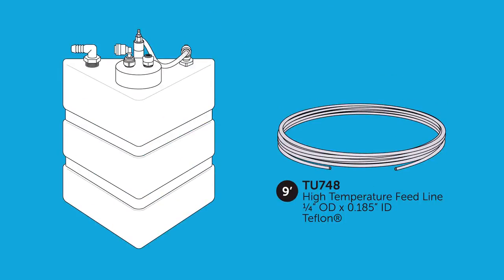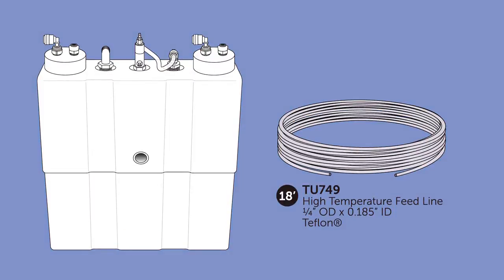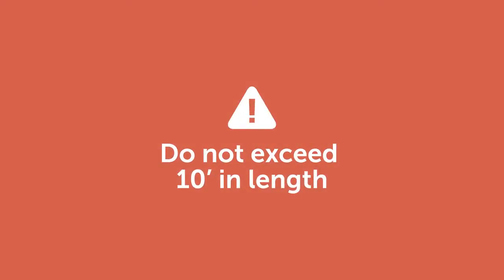A 9-foot length of the high temperature Teflon tubing is included with each model V7501 for a single autoclave, and an 18-foot length is included with each V7502 system. It's important not to exceed 10 feet in length for any individual section of tubing between a sterilizer and the VistaCool. Always try to minimize the length of tubing to prevent traps and pooling in the lines.